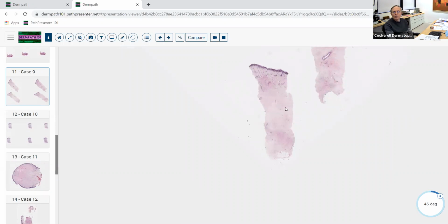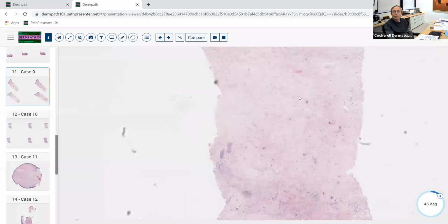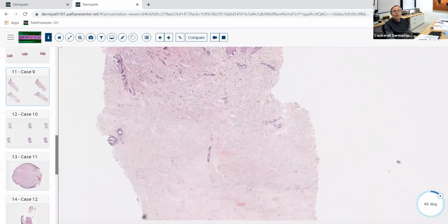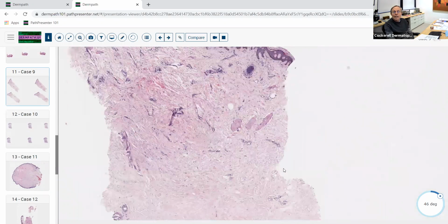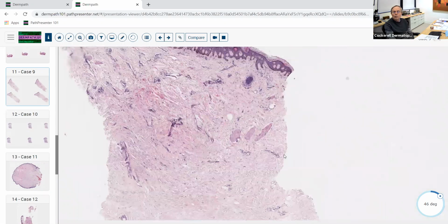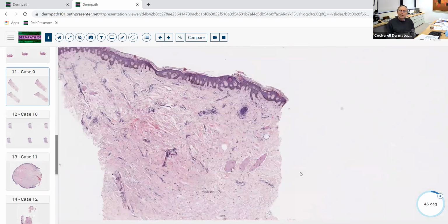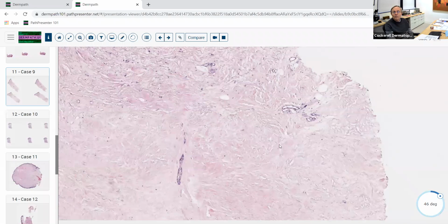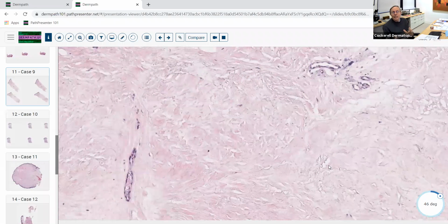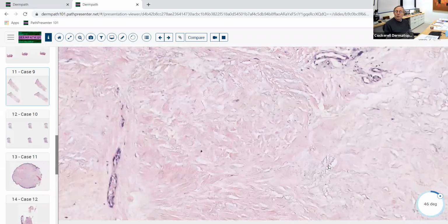And sometimes there's another sclerotic condition where patients get radiation therapy and they get chronic radiation dermatitis, and this is an example of that. This is interesting here, we don't usually get biopsies of chronic radiodermatitis that extend deep. Most of the biopsies of chronic radiation dermatitis are usually taken by shave technique, where the clinician is concerned because it's maybe crusted and oozing. They want to make sure that there's not a recurrence of a cancer or something like that. But in this case, we've got this sclerosis that extends deep down into the mid-reticular, lower reticular dermis.